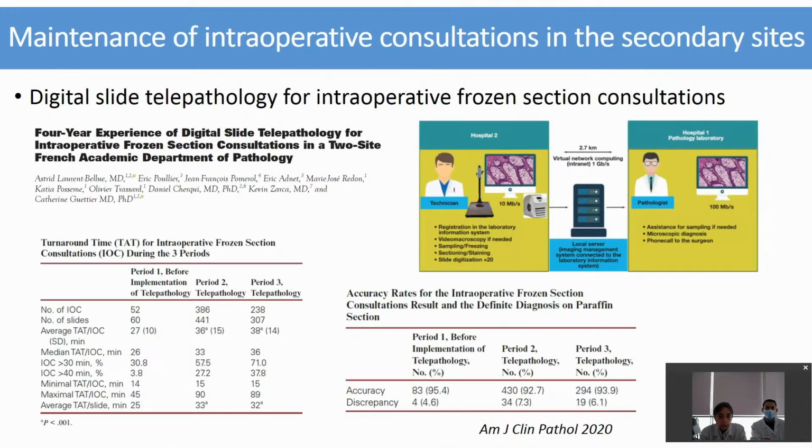The first challenge was to maintain intraoperative consultations for the 2 secondary sites while optimizing medical time. Technicians are alone on the secondary sites without pathologists, and this has been feasible thanks to digital telepathology with an adequate diagnosis accuracy rate, more than 92%, but a slightly longer turnaround time, plus 7 minutes per slide, as reported in this article we published last year.